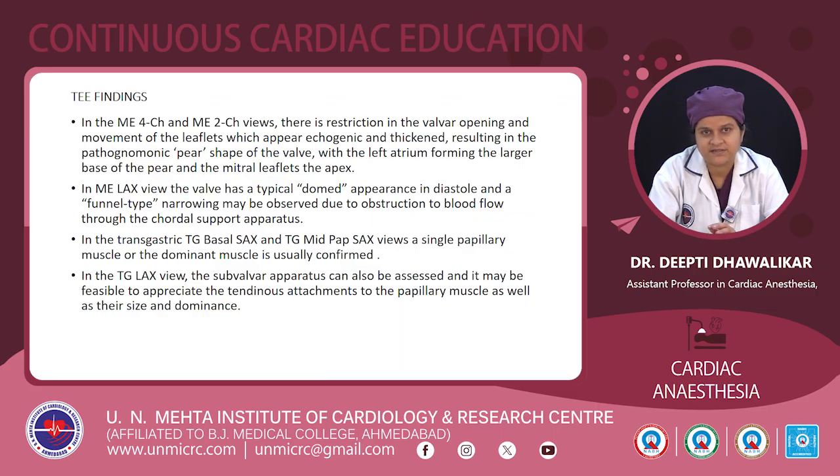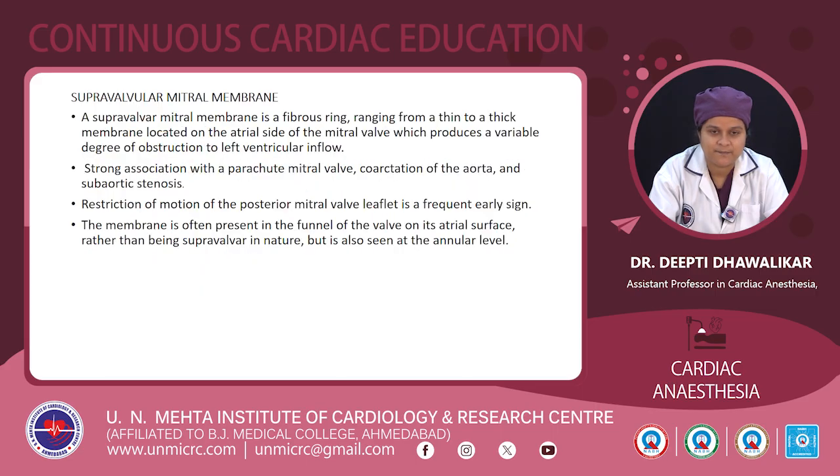In the transgastric basal short axis and transgastric mid-papillary short axis views, only a single papillary muscle or the dominant muscle is usually confirmed. In a transgastric long axis view, the subvalvular apparatus can also be assessed, and it may be feasible to appreciate the tendinous attachment to the papillary muscle as well as the size and dominance.